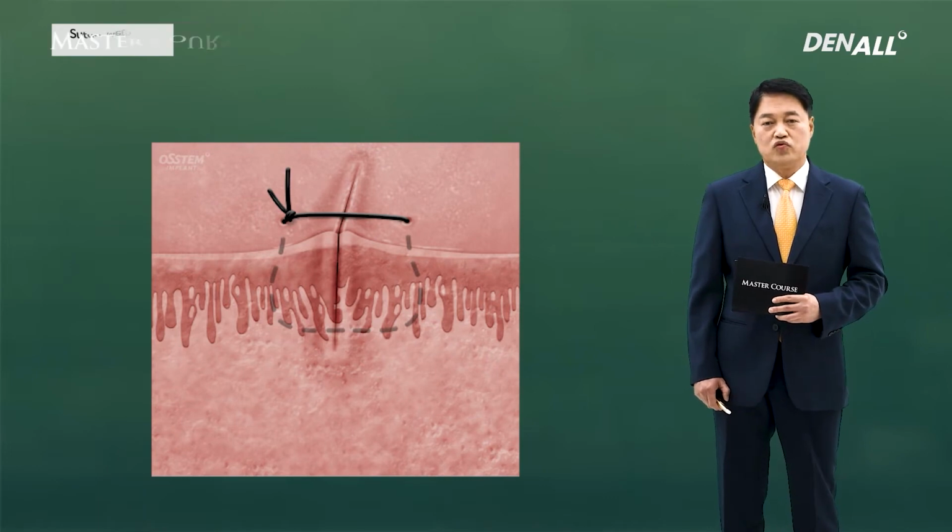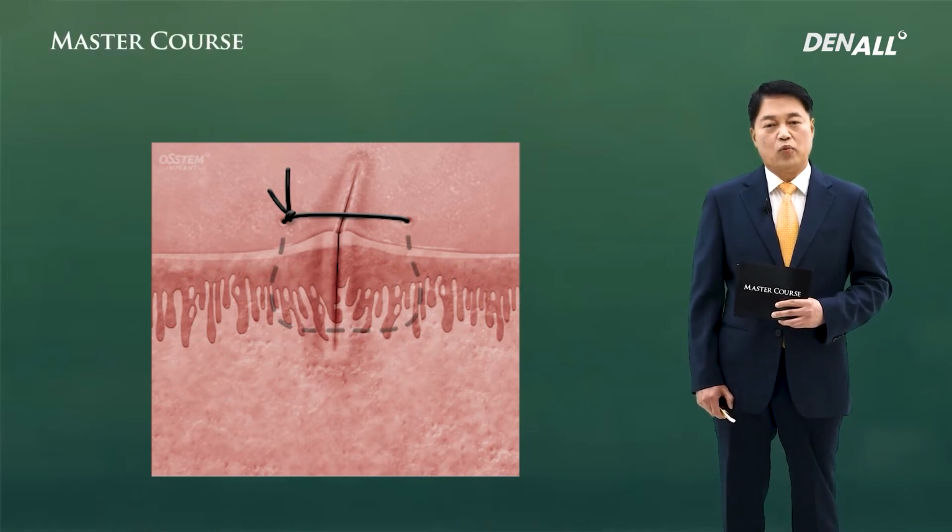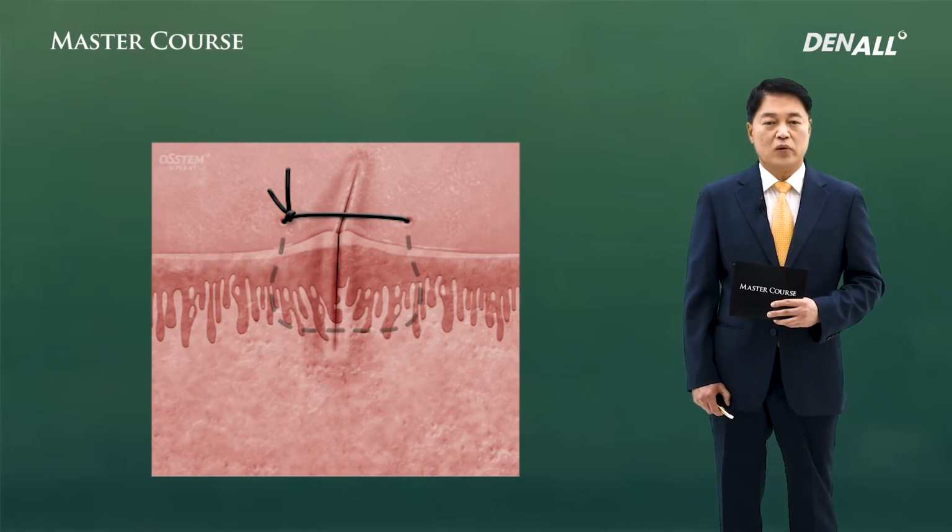Of course, not all sites need U-shape suture, but if you need a good closure like when you have done GBR, then aim for U-shape suture in 2 steps.